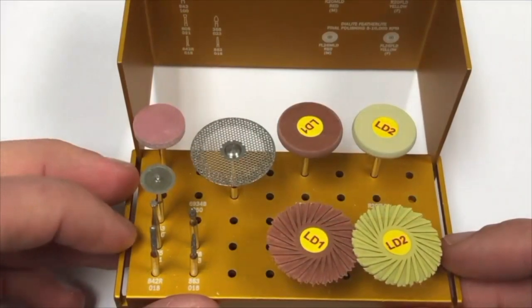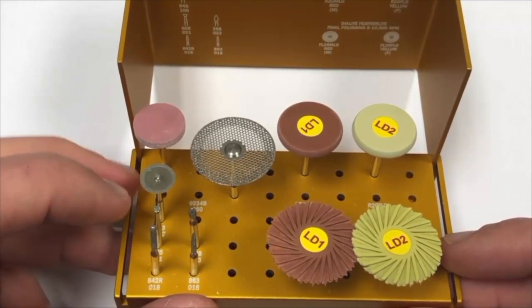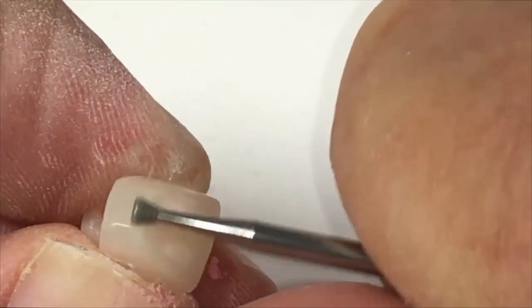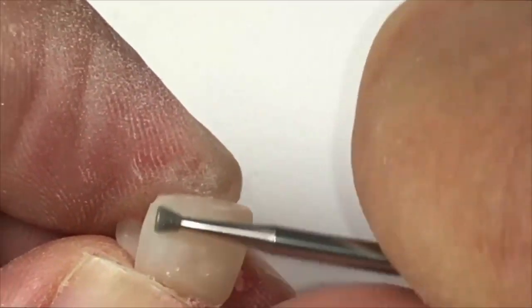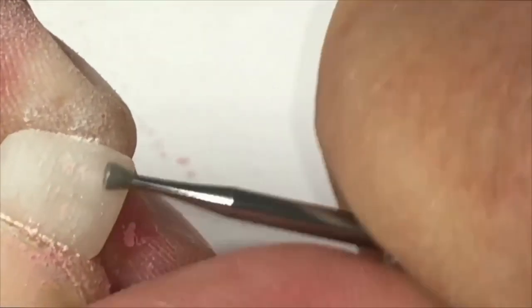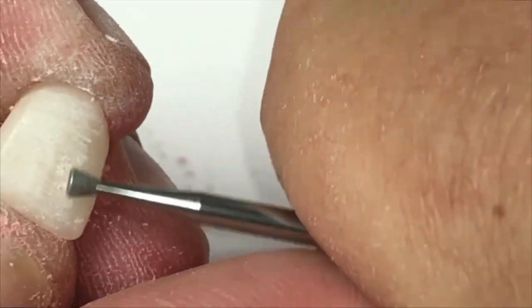After initial polishing of the surface with the medium Dialite Wheel, additional anatomy can be added with the 805021 inverted cone diamond. It is important to add additional anatomy after the medium Dialite Wheel to prevent initial polishing from removing the anatomy. Anatomy is added based on what you are trying to match. An effective technique is to create both horizontal growth lines and vertical striations to mimic the look of a natural tooth.